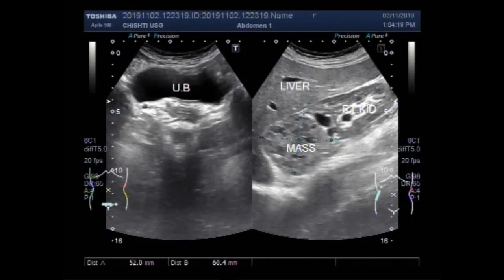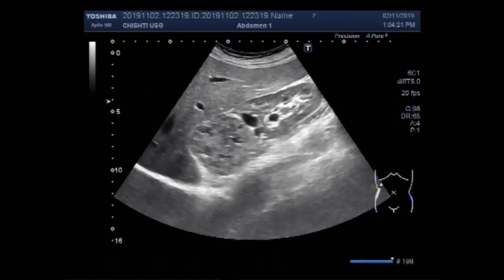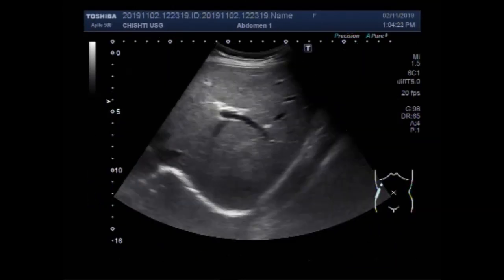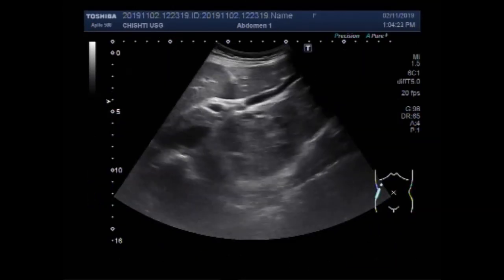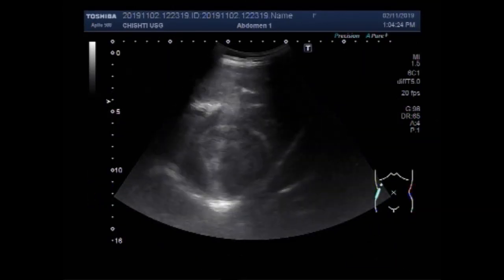Dear viewers, I hope you are all fine. This ultrasound video shows a renal mass.